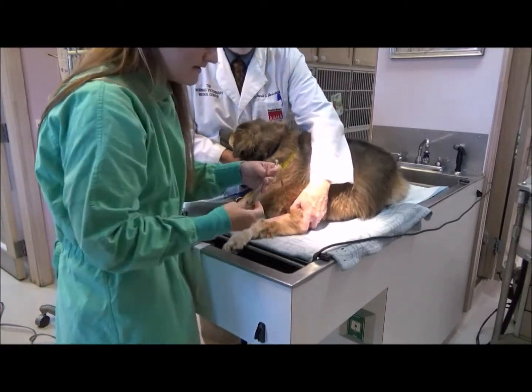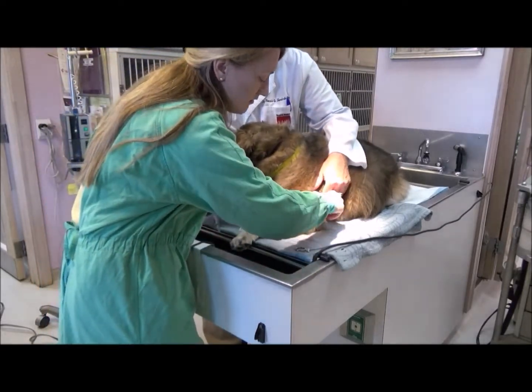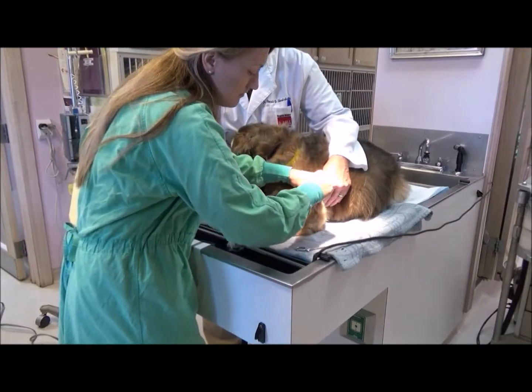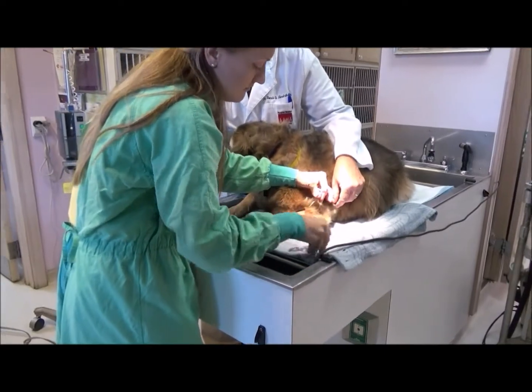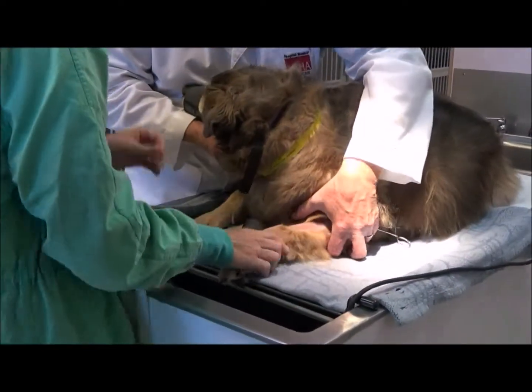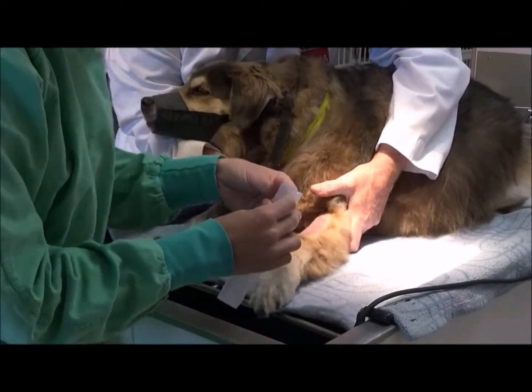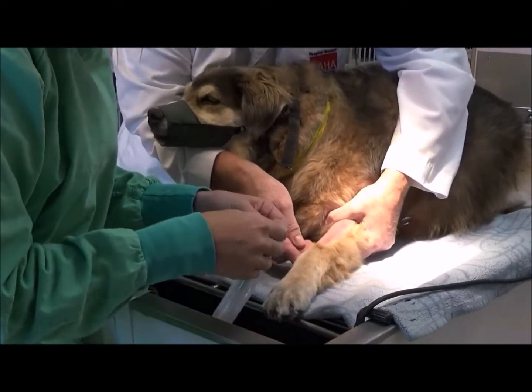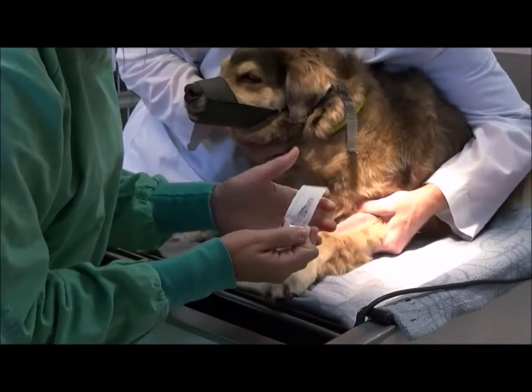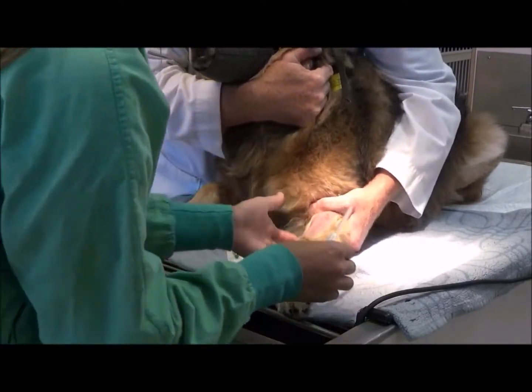So now I'm going to place the tourniquet on the leg here. Place it just behind the elbow. Okay, and then next I'm going to open my IV catheter. So you want to be careful to use aseptic technique when opening it. Mostly the catheter itself, because that's what's going to be going into the vein.